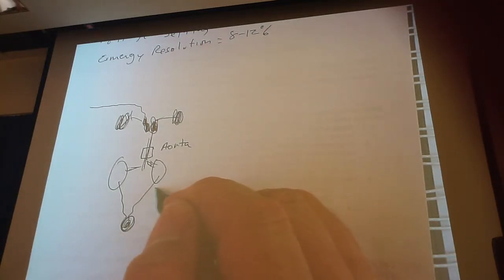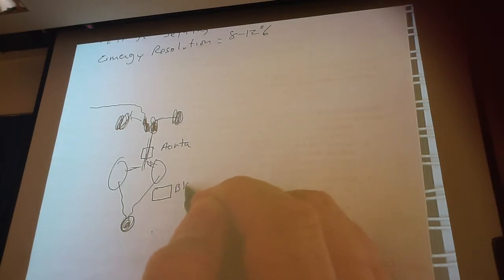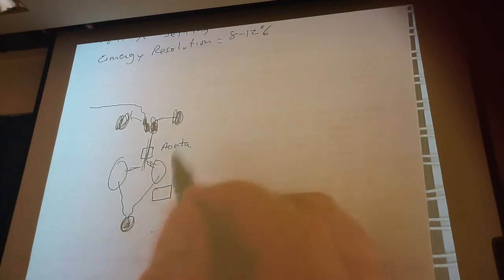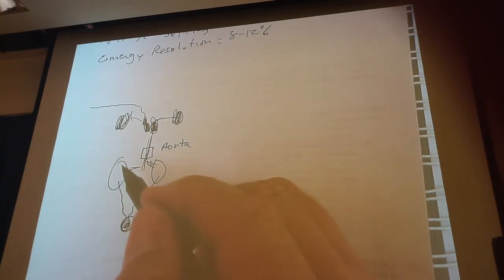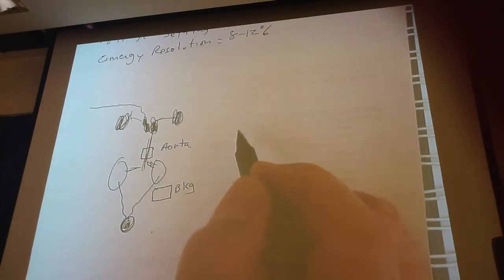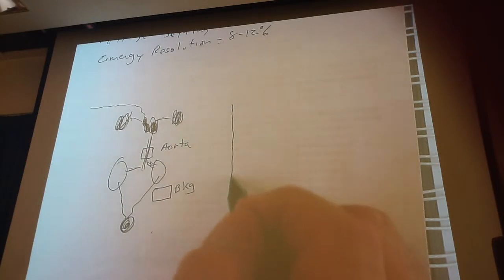Remember, you also have a background out here, too, that you subtract. Sometimes you just have one region of interest as the left kidney, then the other region of interest is the right kidney, and then you have aorta, and you have background. Some places do the bladder, some places do the cortex, some places do the cortex and the medulla. Anyway, so the thing that you're looking at is this.